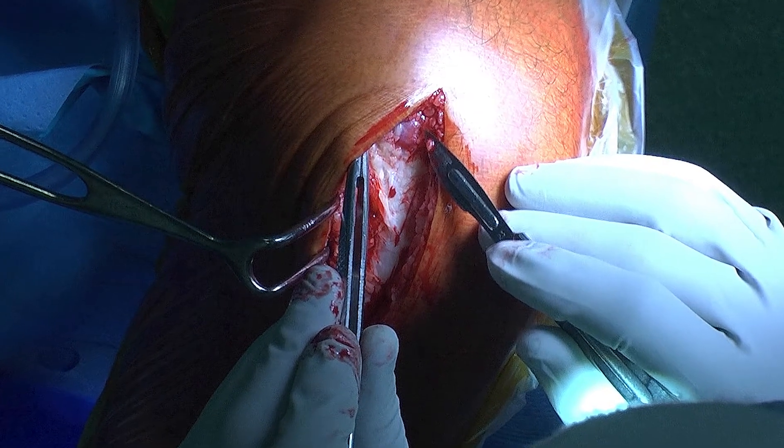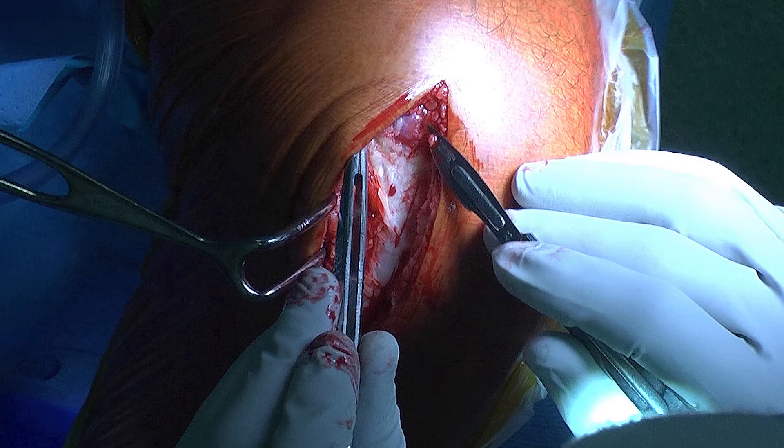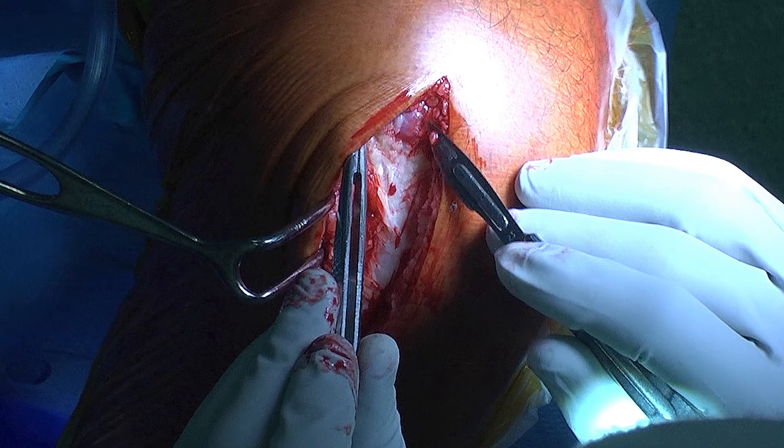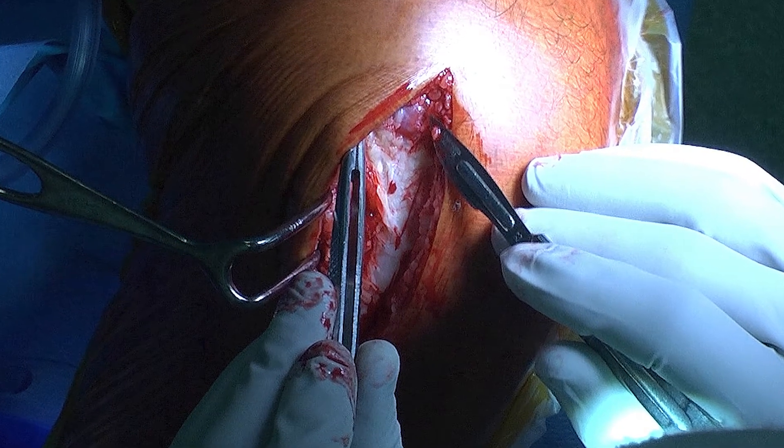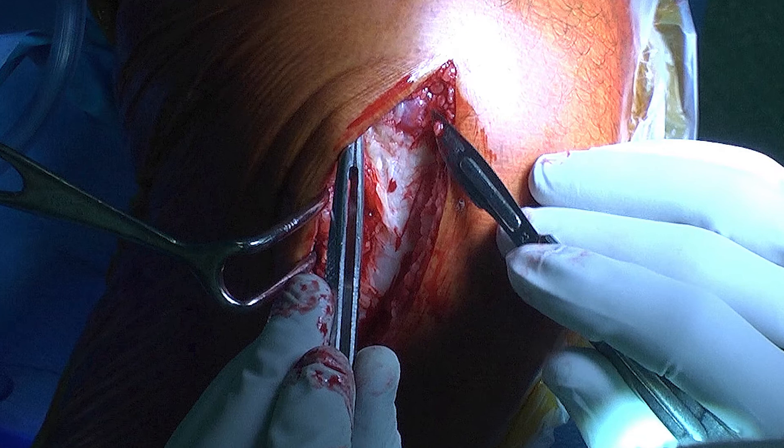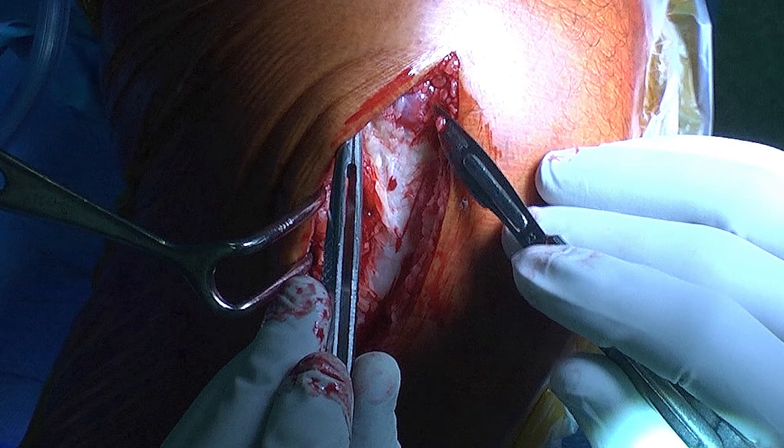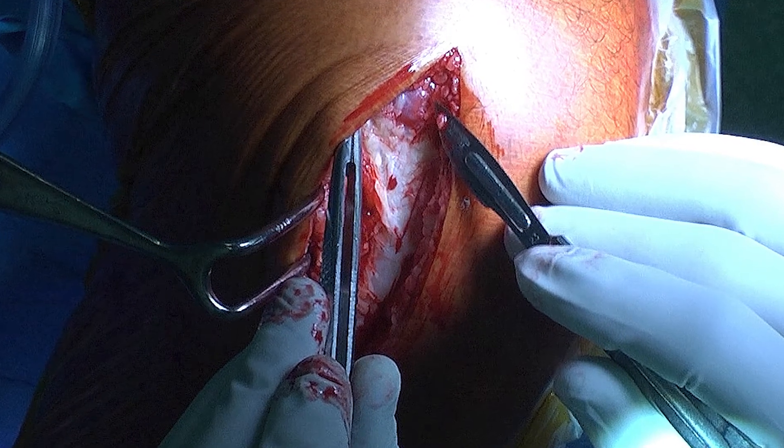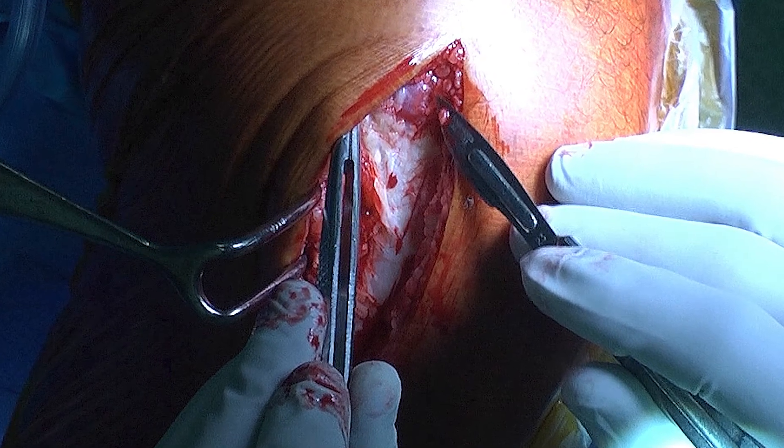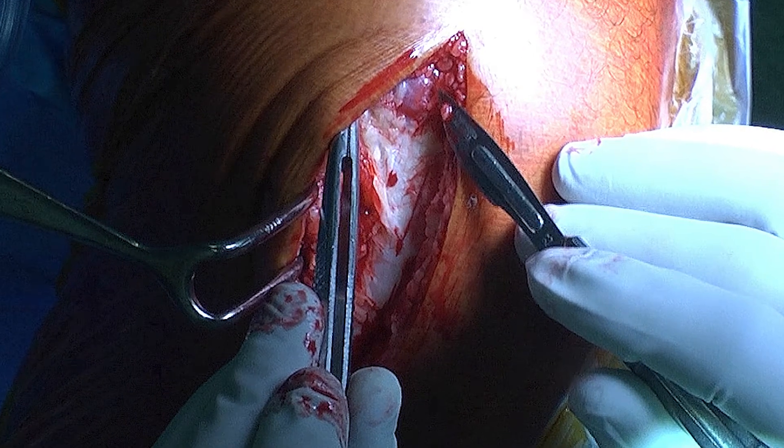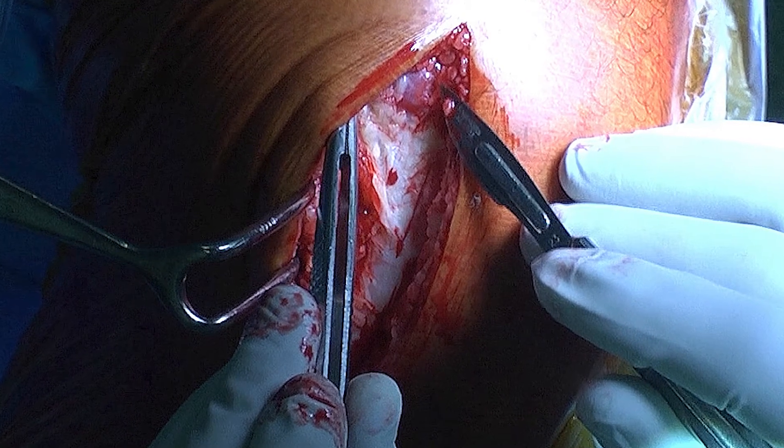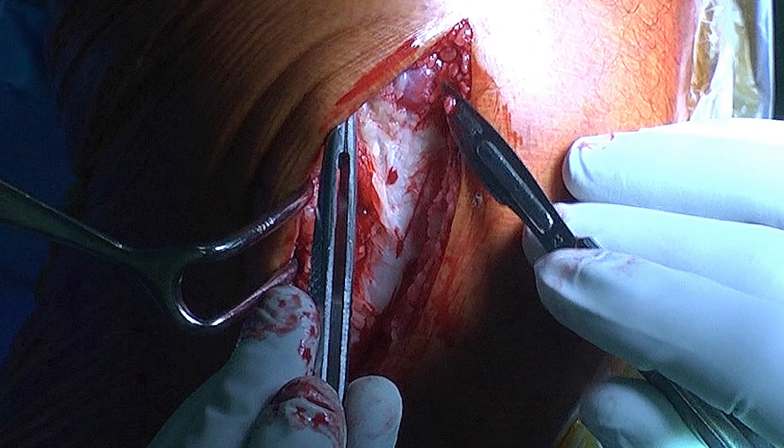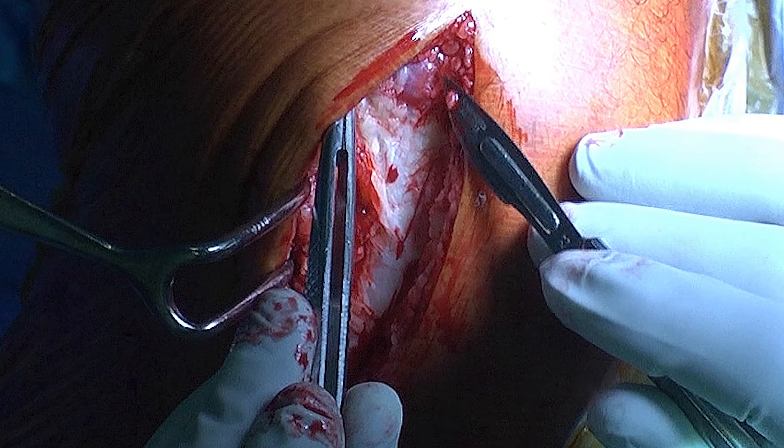Once I'm happy with the position of the trackers, a minimally invasive sub-vastus approach is made to access the medial compartment of the knee. As can be seen, the muscle belly of the vastus medialis can be seen at the top part of the wound, and an L-shaped capsulotomy is made to get access to the joint.